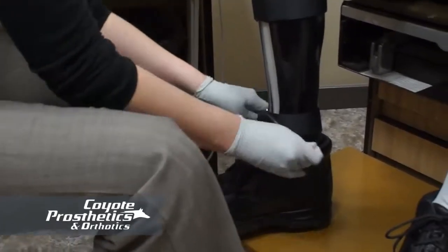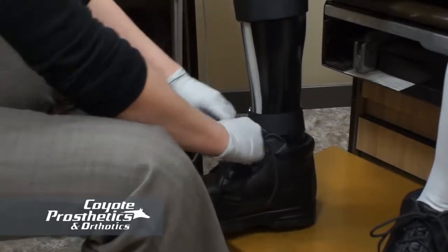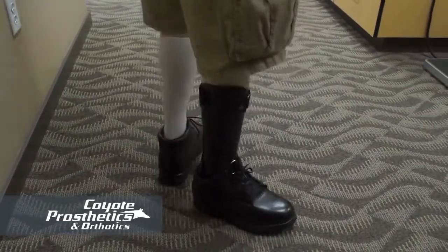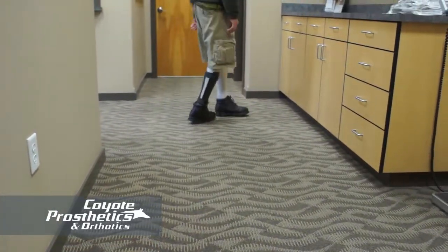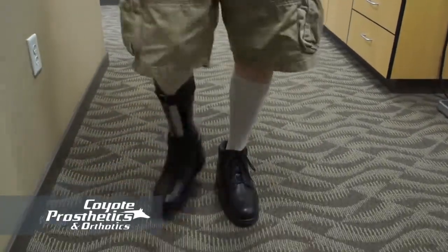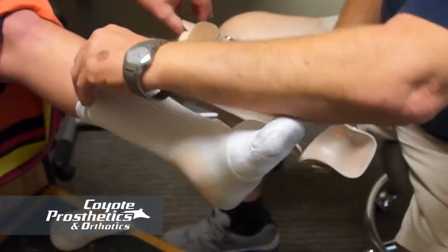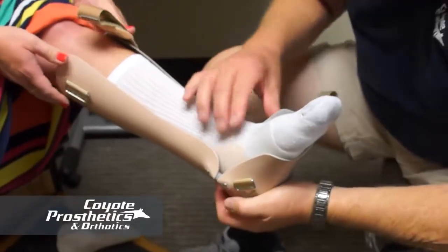When you first start wearing your AFO, you're going to want to break it in gradually — just like a new pair of shoes. Wear it one to two hours the first day, two to four hours the second day, and generally increase your time. You should be wearing it full time within about a week. If you have any problems before your follow-up appointment, give your orthotist a call. In most cases they'll get you in sooner, and it's not uncommon to need minor adjustments.